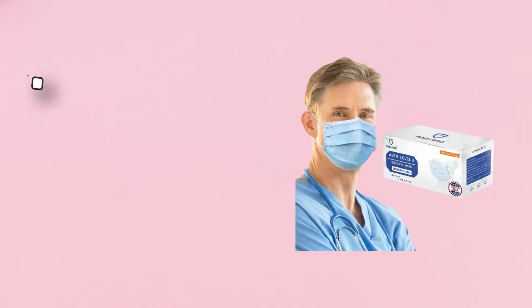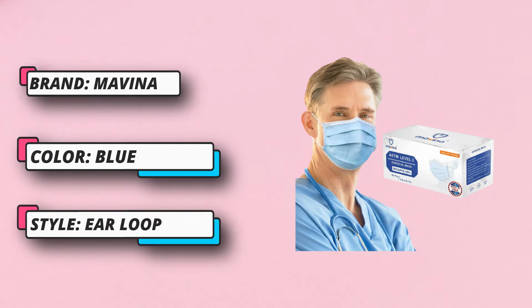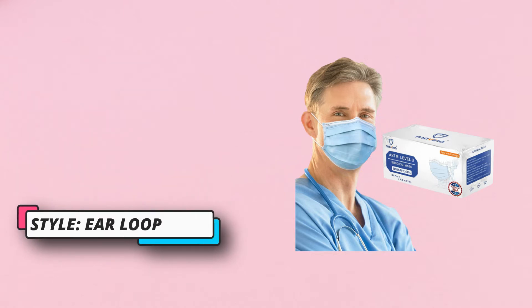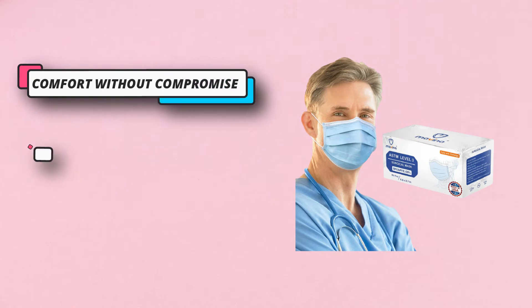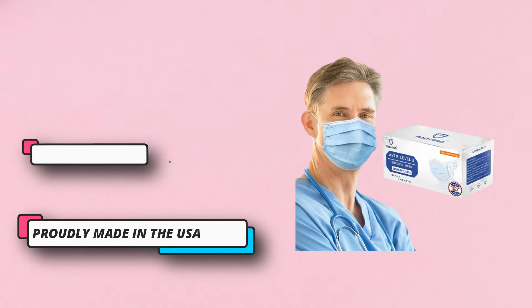Proudly made in the USA — all raw materials sourcing and face mask manufacturing are done in the United States. Comfort without compromise is what our Level 3 Surgical Masks stand for. No longer do you need to choose between comfort and protection; with our masks you can have both.